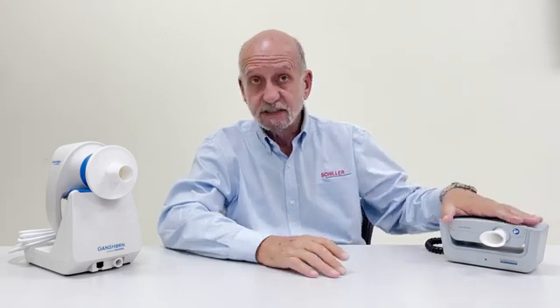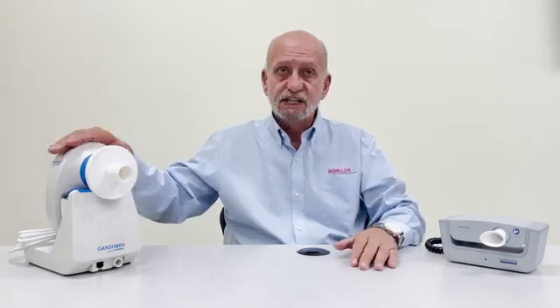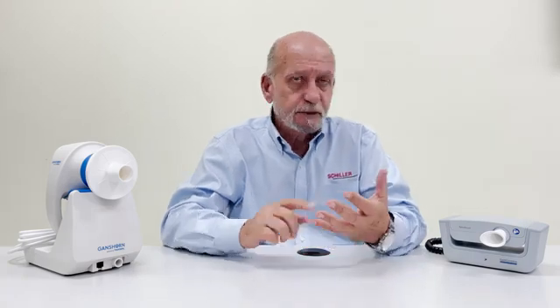we traditionally diagnose with spirometry is not the best way, let's say, because of that full range of plus 20, minus 20% of predictions. While with oscillometry, it's a lot easier to see if there is an obstructive problem, and if the obstruction is either on the peripheral side or on the central side of the lung.